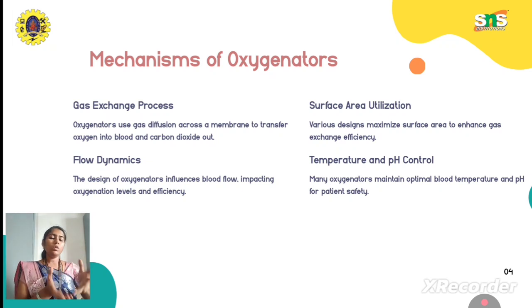So on the whole, if you take any kinds of oxygenators, the main mechanism is the same across these four.